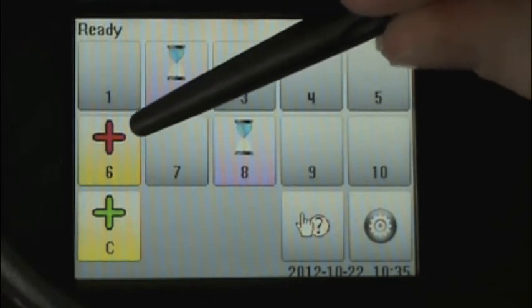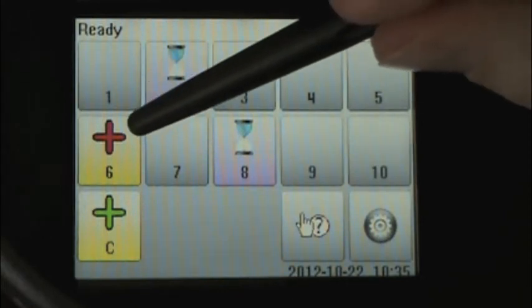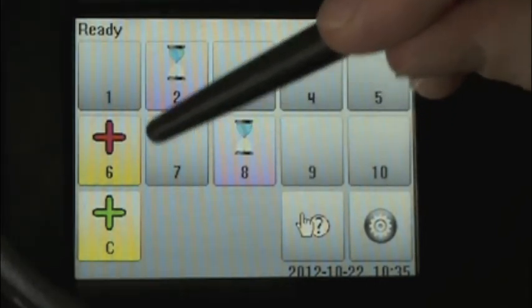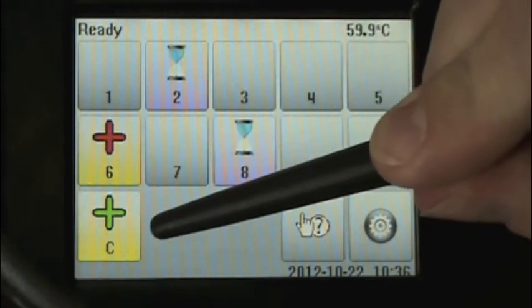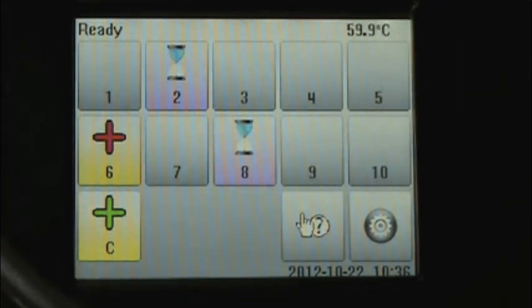We can look at cell number six, and here we see a yellow background color because this biological indicator is growth positive and the media has changed from purple to yellow. We also get a red plus sign indicating the growth positive result, and the plus sign is red because this is an undesirable result. In a sterilization cycle, we expect all of our biological indicators to be growth negative, and here we have yellow media indicating growth positive and the red plus sign. In a positive control cell, growth is the desired result. So here we can see the yellow background indicating the media has turned yellow, but we have a green plus sign because this is the desirable result in a positive control compared to an undesirable result in a test biological indicator.